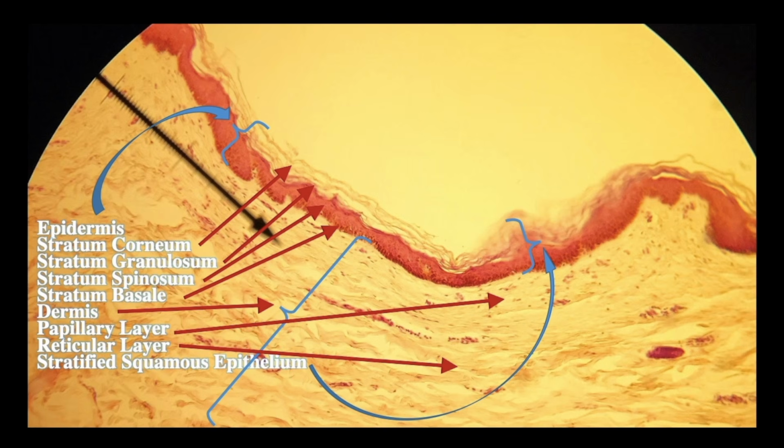In another video, I will show you the difference once we get to skin. I'll make a video specifically just for skin, so we'll talk about all the layers of the skin specifically. So for now, we're just going to skip that.